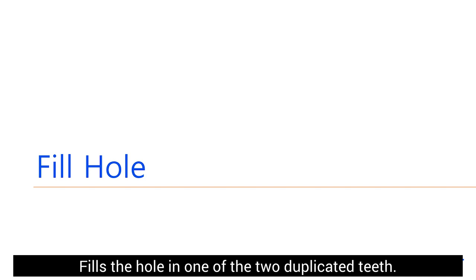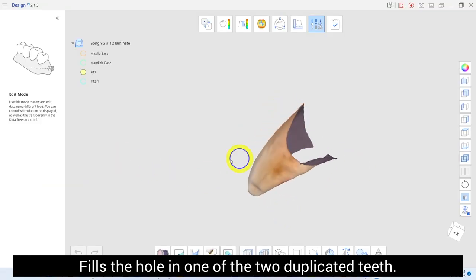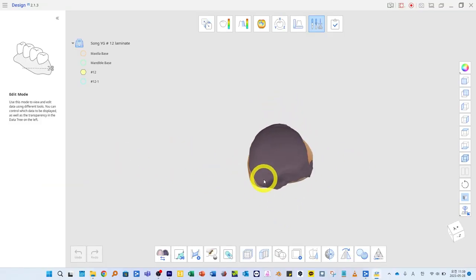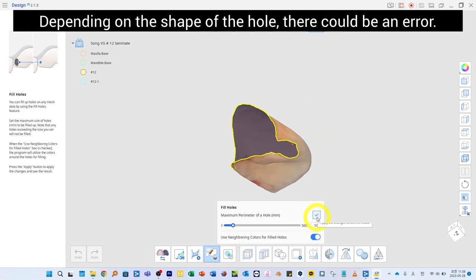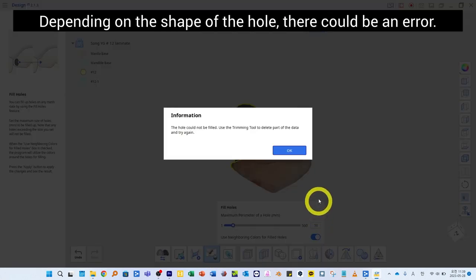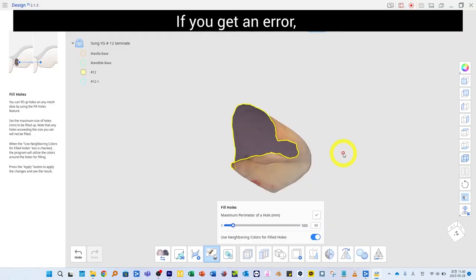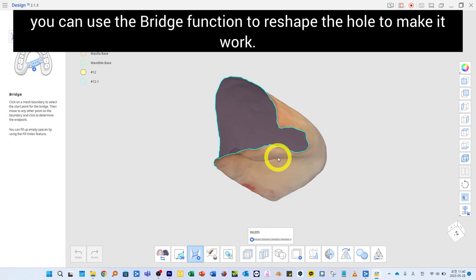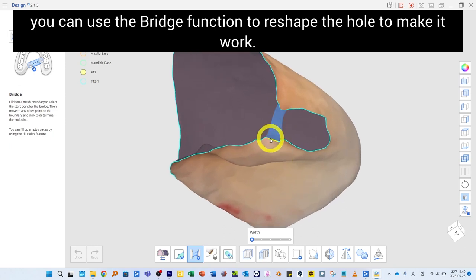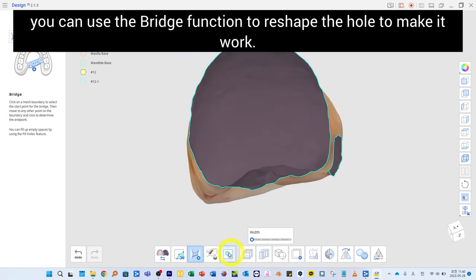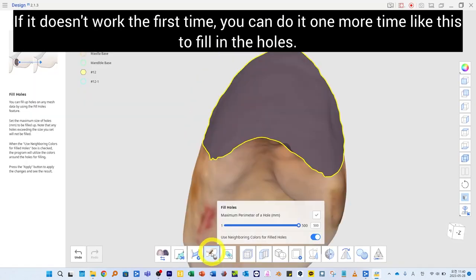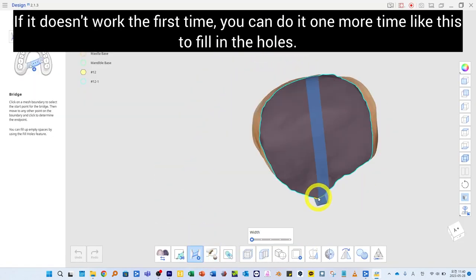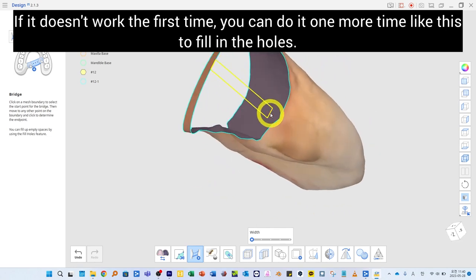Fill the hole in one of the two duplicated teeth using the Fill Hole function. Depending on the shape of the hole, there could be an error. If you get an error, you can use the Bridge function to reshape the hole to make it work. If it doesn't work the first time, you can do it one more time to fill in the holes.